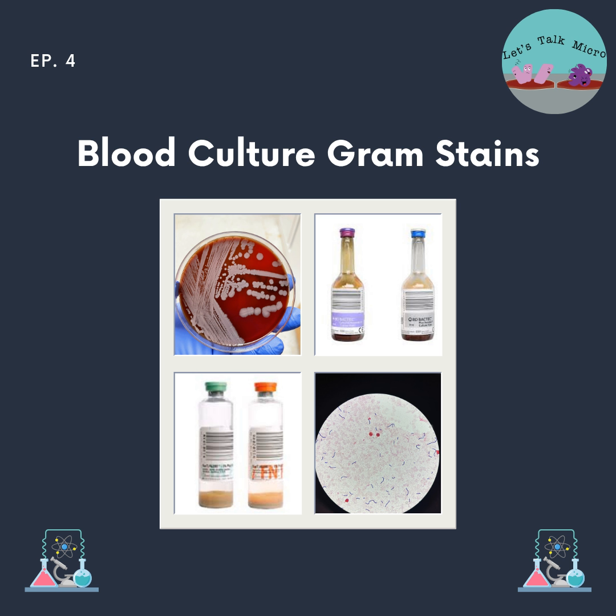And sometimes we are low on supplies. Those of you that work in the lab have dealt with the pain of media being on back order. You start running short. A lot of times it happens with the chocolate. So if you're running low on chocolate, go ahead and just set up the blood and the MacConkey. And then if you are suspecting Haemophilus, you go ahead and add a chocolate plate.